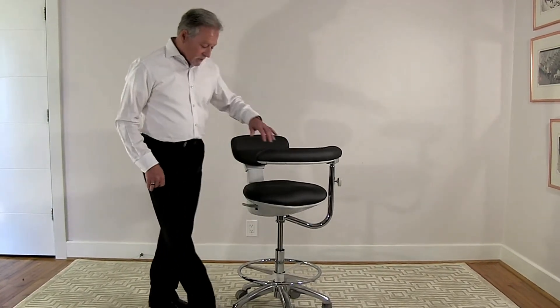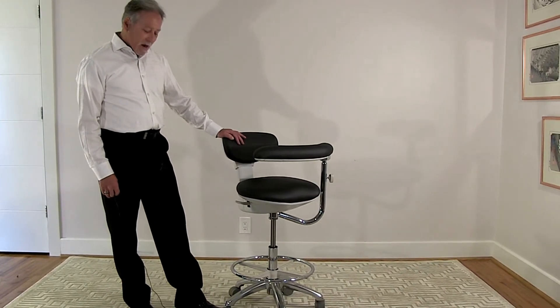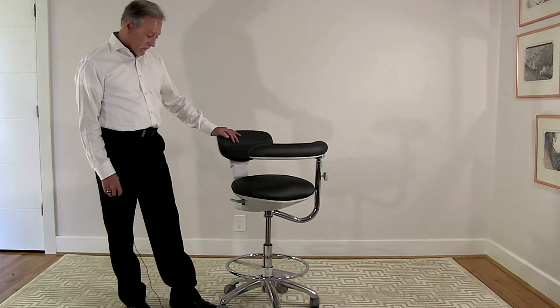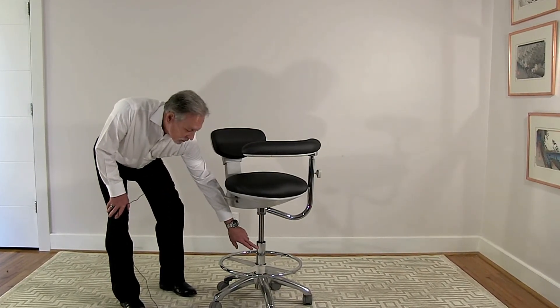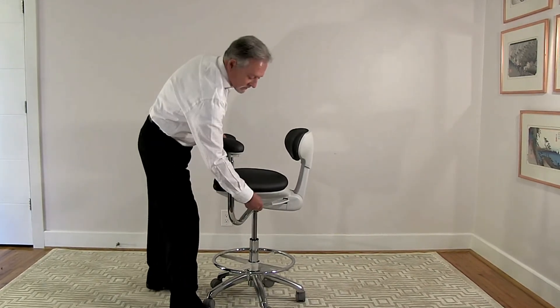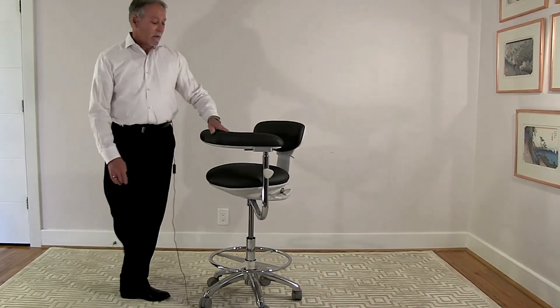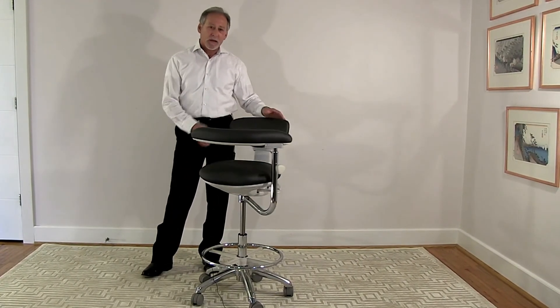Other features of the stool include a fully polished five-legged base, very high grade 65 millimeter twin wheel casters, and a tall assistant-size chrome plated cylinder which offers multiple adjustments for height. This is the C140A Assistant Aurora Stool from Crown Seating.